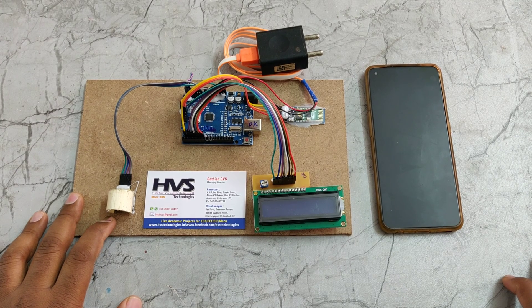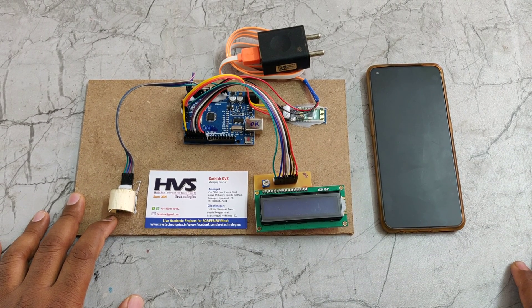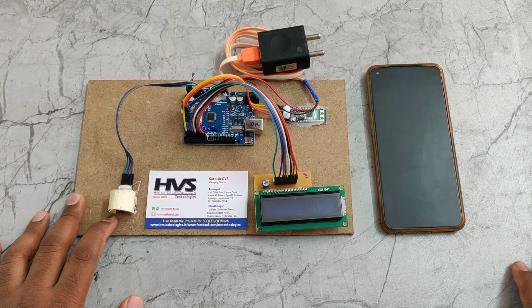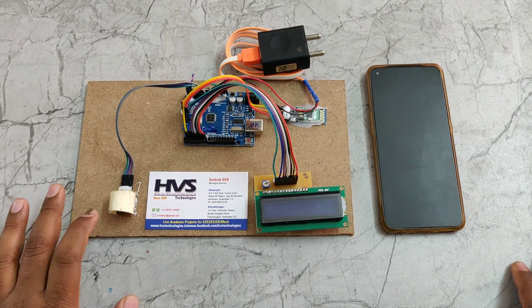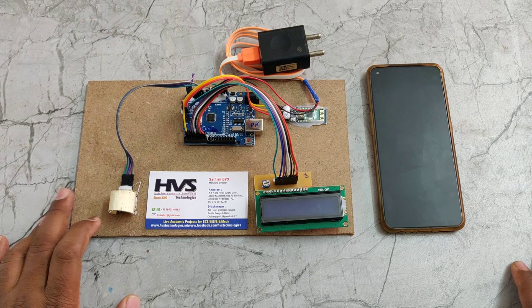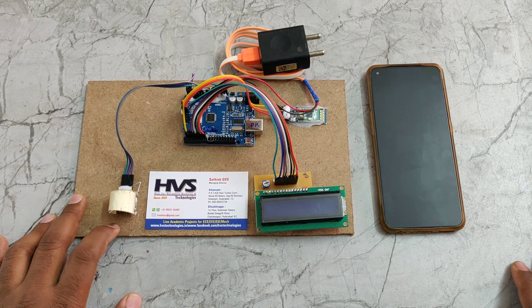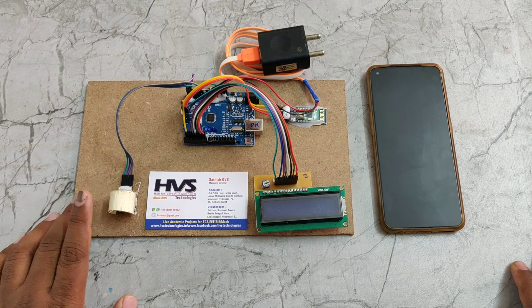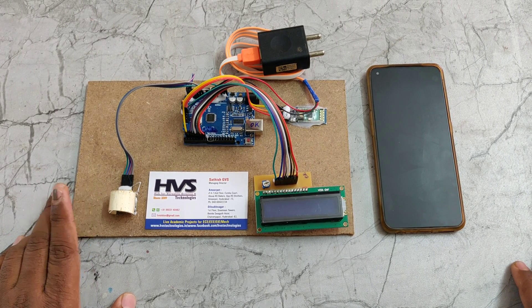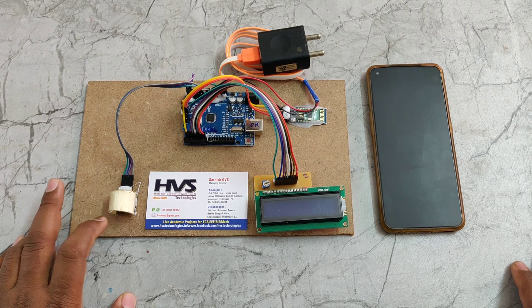It has two sensors mainly: a red LED emitting indicator along with a phototransistor and a light dependent resistor along with IR. The IR sensor is used to detect finger presence inside this module. The red LED emits red light that travels to the finger, and the red blood cells reflect that emitted light, which is then received by the LDR sensor.